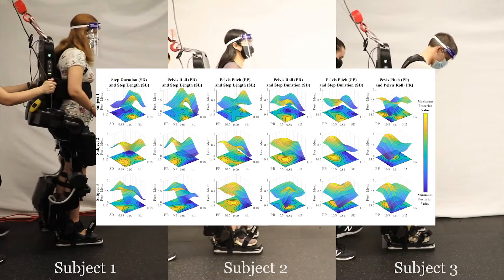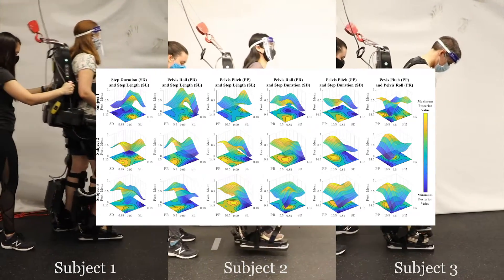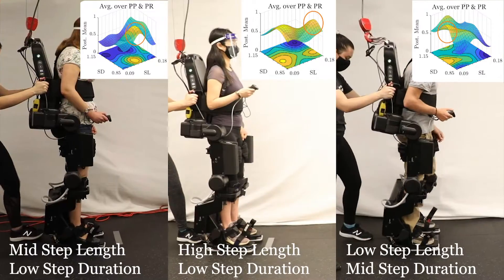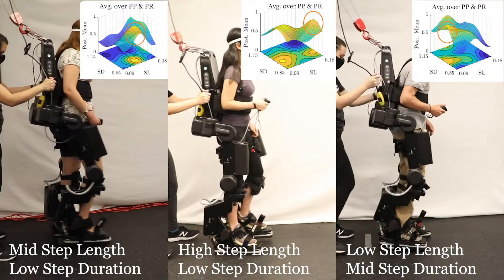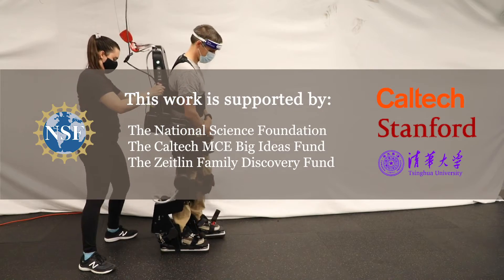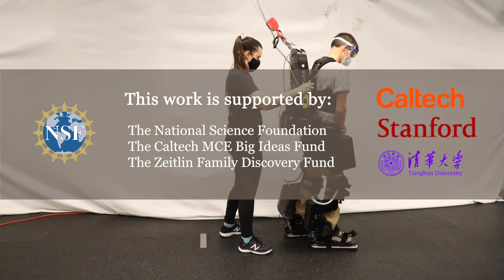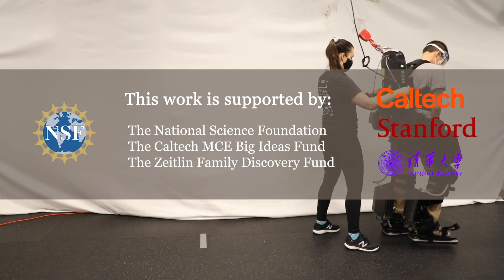These learned landscapes highlight both regions of agreement and disagreement among the subjects. For example, all subjects strongly dislike gaits at the lower-bounded pelvis pitch and pelvis roll. However, all subjects disagree in the most preferred gait region of their utility landscapes across step length and step duration. This work presents progress toward better understanding the mechanisms behind user-preferred walking and optimizing future exoskeleton gait generation for user comfort.